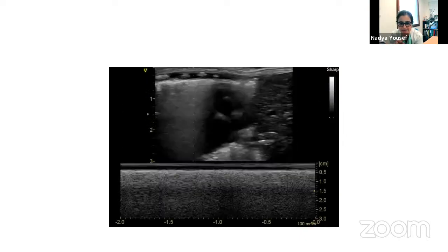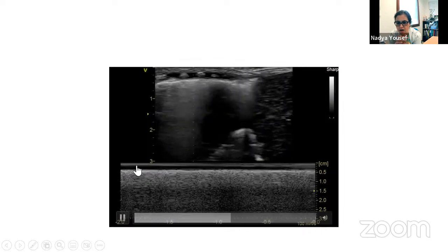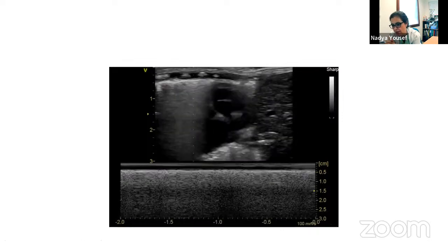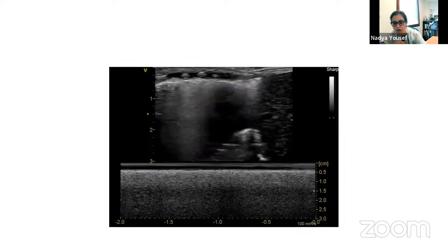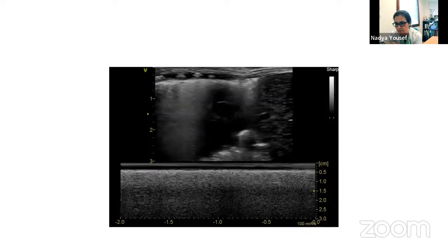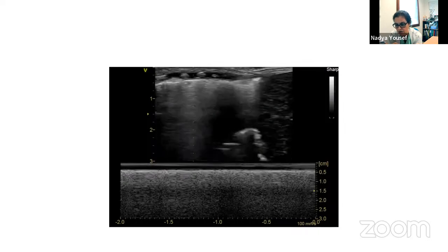I'm calling it black area, but if we go to the right side of your screen, still above there, you can see the horizontal lines. On the other side, I'm sorry, I don't know what's right and left on what is being projected. If you had that image all the way down, that would have been a stratosphere sign. But here you don't. You have a clear difference between the upper part, and if you had possibly a larger area that was subcutaneous tissue and so on, this narrow area would have been larger.